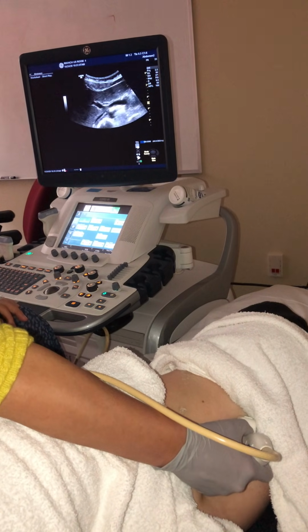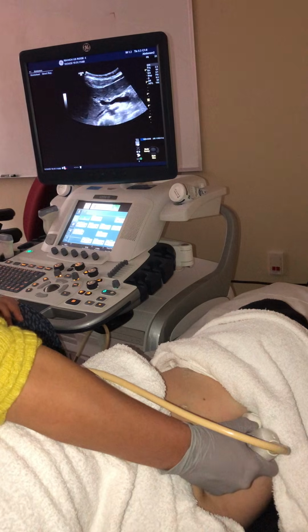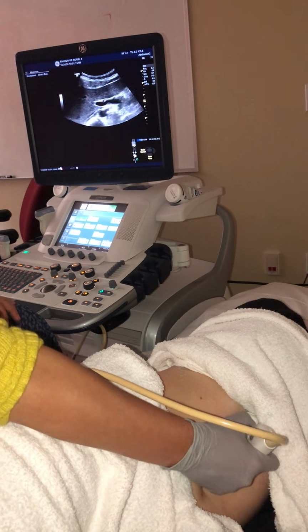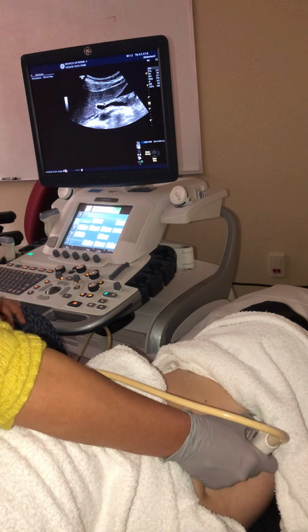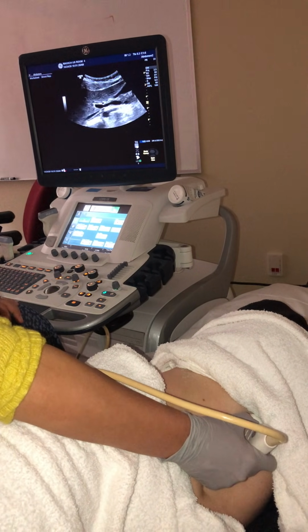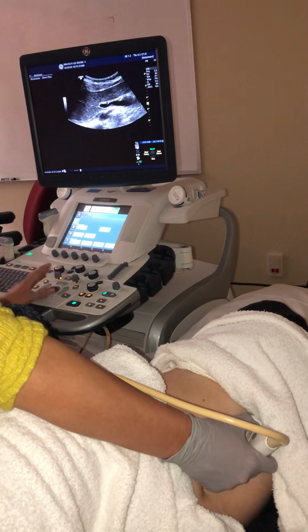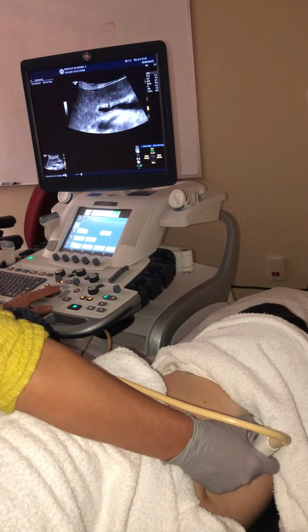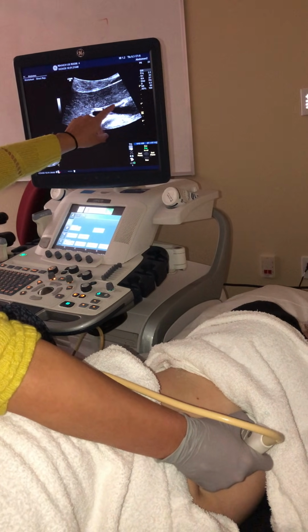So you want to play with your transducer angulation, and you want to go on an oblique plane. You're still kind of angling towards her right shoulder. Still going to be sitting parallel to the portal vein, just on top. So it's an anechoic tubular structure here. Really small, really narrow.